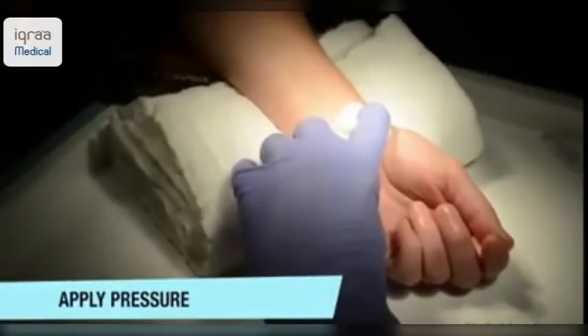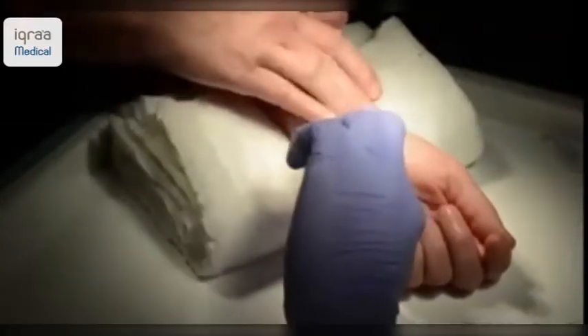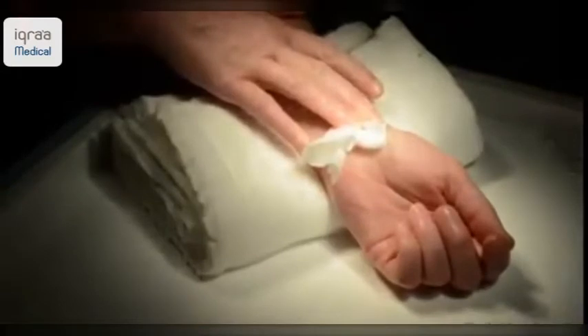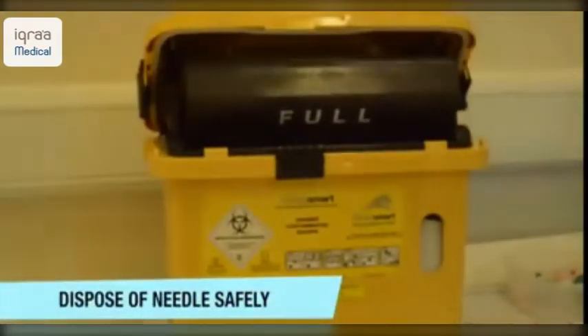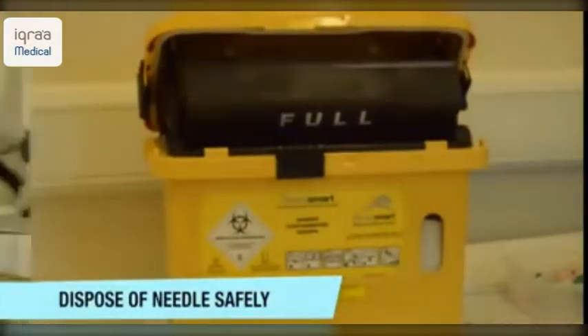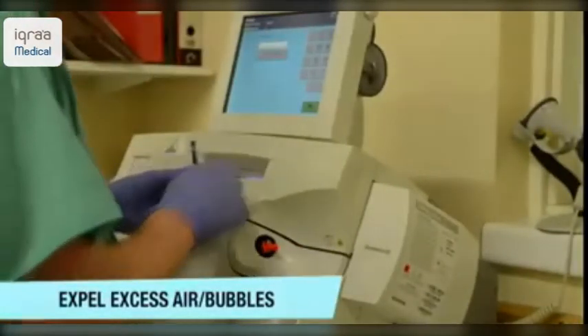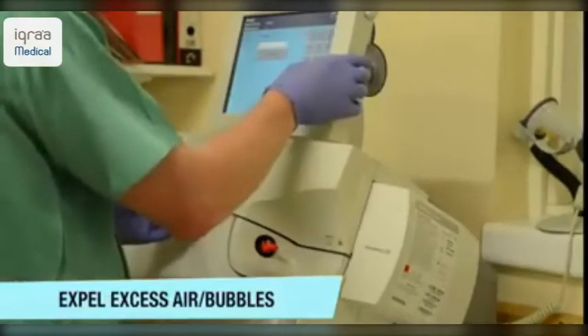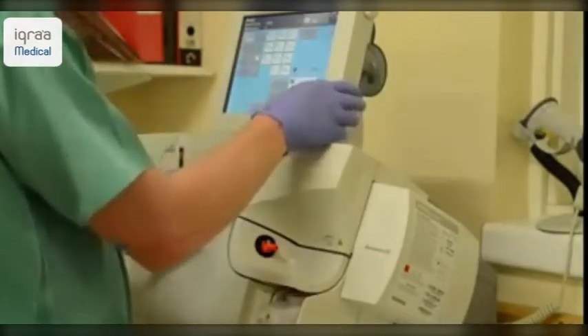Once you've removed the needle, ensure that you apply pressure to the arterial puncture site for anything up to 5 minutes. Ensure that you have disposed of your sharps safely before taking your sample and analysing it in the ABG machine. Ensure that you have expelled any excess air using the filter cap provided in the pack.